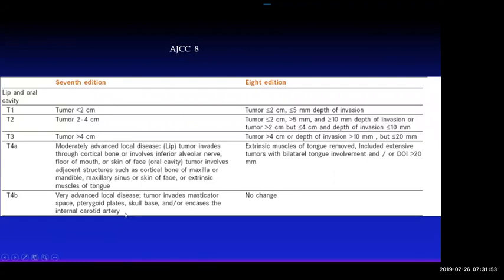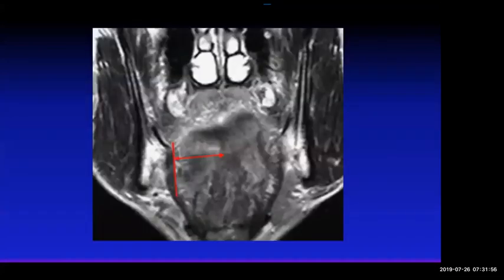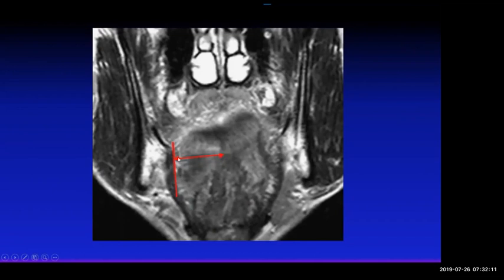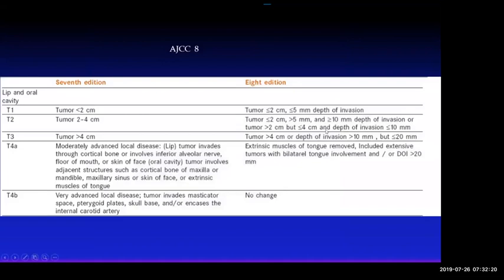Depth of invasion is a new concept. You draw a straight line along the lateral margin of the tongue, then draw a line perpendicular to that — that horizontal measurement is the depth of invasion. It can be less than 5 mm, between 5 and 10 mm, or more than 10 mm. If it's more than 20 mm it becomes T4A.